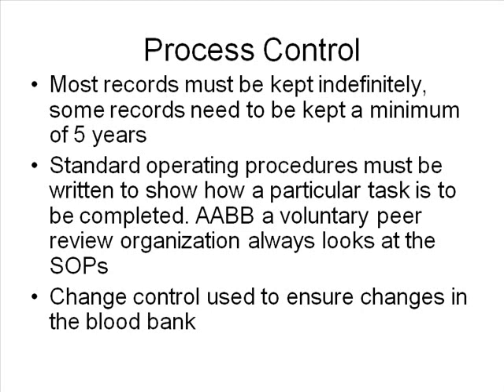You must write then in the record, this is where I cross it out. I write returned, time, date, and temperature. Okay? And if it was wasted, I write on their unit wasted. And I make sure I write on the unit wasted. Not good, take out of inventory so that you know.